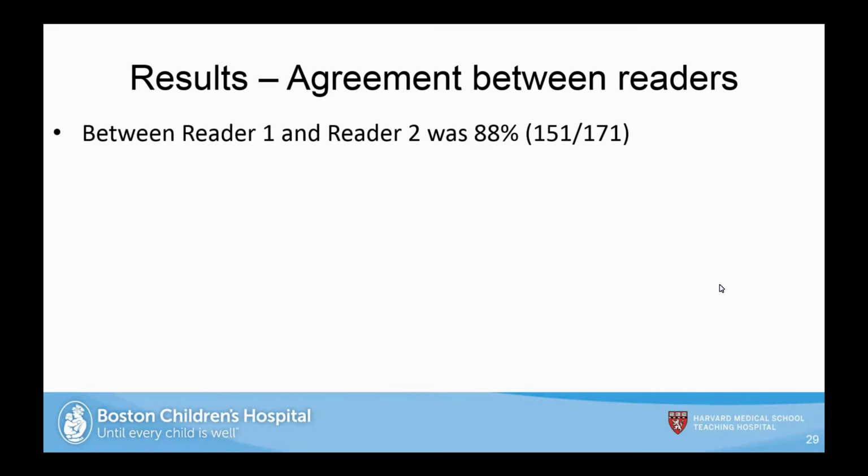I think they didn't specify, but diagnostic is whether or not they could use the image. They explained that it's basically whether they could use that image to detect cirrhosis or a liver lesion. If a radiologist was looking at an image that was of kind of poor quality, borderline, but they could still read it, maybe they would label that as diagnostic, versus another radiologist who would say, I can see it, but this image is contaminated with an artifact, so I'll label that as non-diagnostic. So maybe they could still see it, but they'll label it as non-diagnostic.